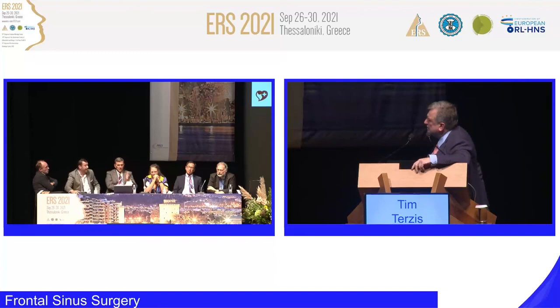Jannis? I will try it conservatively in the beginning, and if the result is not good, then I will open it and see what is the problem, what is the reason for the obstructions. I cannot tell that. I cannot see in the CT now which is the reason for the obstruction. Yeah. I think we have to see, maybe a scarring, maybe a circumferential traumatization of the mucosa. You know, actually, we have to see.